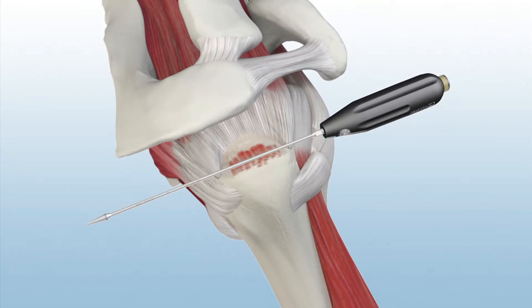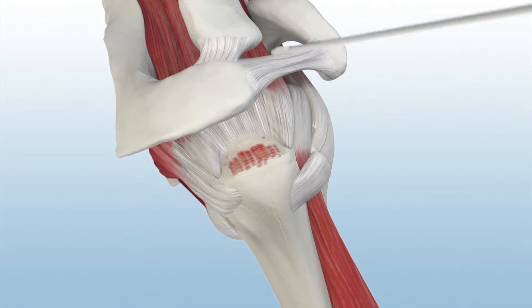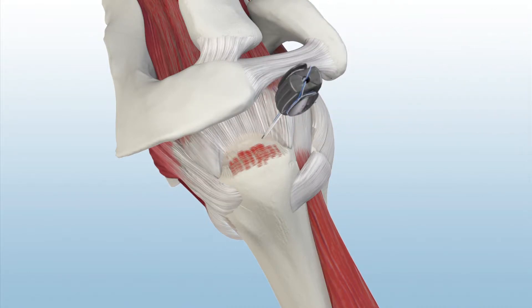The Genesis CrossFit broach punch is inserted down to the laser line. Then the triple-loaded Genesis CrossFit Anchor is inserted down to the laser line so that the anchor is sub-flush. The inserter is then removed.